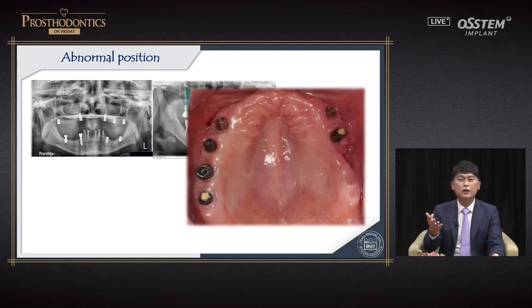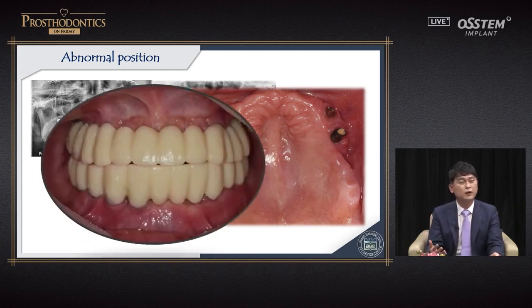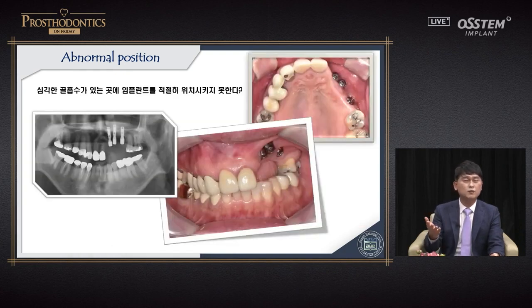Ten years ago, the patient was in the 70s without systemic disease, but over the 10 years, the implants fell out and the patient has diabetes and had stent surgery. We cannot place further implants in this patient. Can we deliver fixed prosthesis?